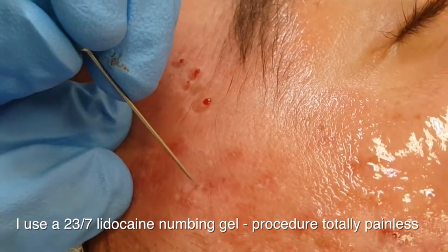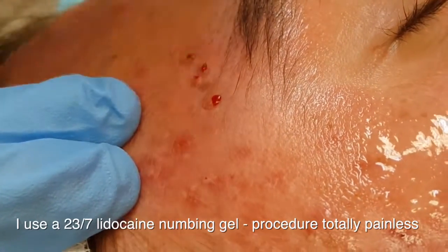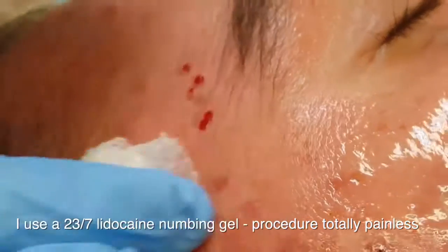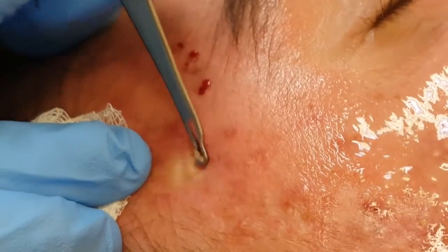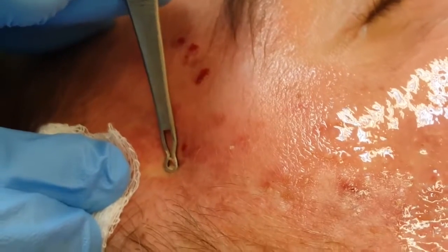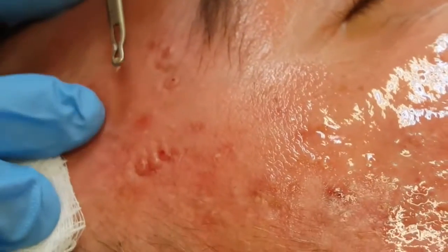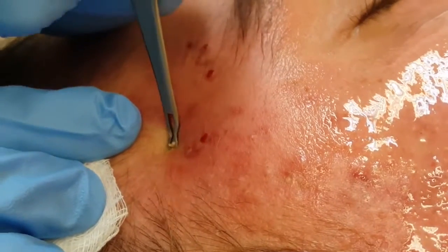Once again, we're just penetrating just the top part of the cyst there into each one. So you can imagine some patients have hundreds of these cysts, and each of these have to be manually extracted. So yeah, we can spend up to 30 minutes or even longer extracting the cysts. So sometimes I do this. Well, I used to do a lot of this, but a lot of my work's taken up with laser now. So it's a joint effort between my nurses and myself, extracting them.